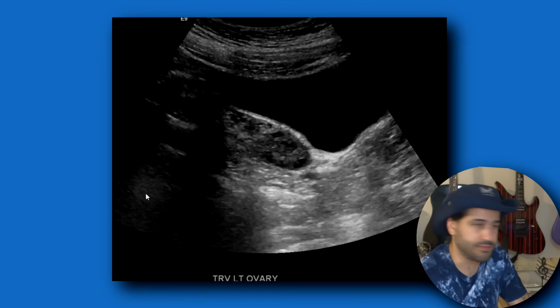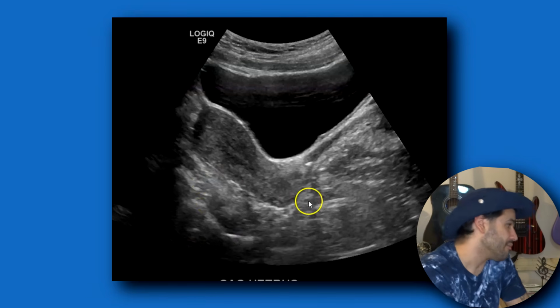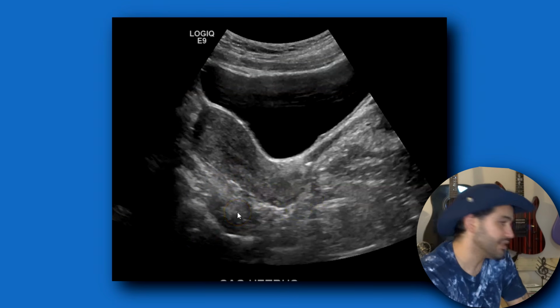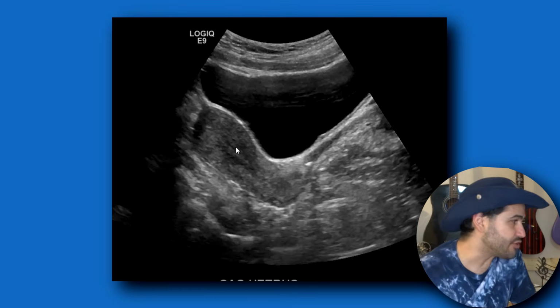We do a lot of these, especially if you work in a hospital that has an ER. You're going to do a ton of them. All right, so don't forget to check for free fluid in the cul-de-sac. Oftentimes you're going to see a tiny bit of free fluid, a mild bit of free fluid. That's normal. It's considered physiological. Nothing to worry about. It's a very straightforward exam.